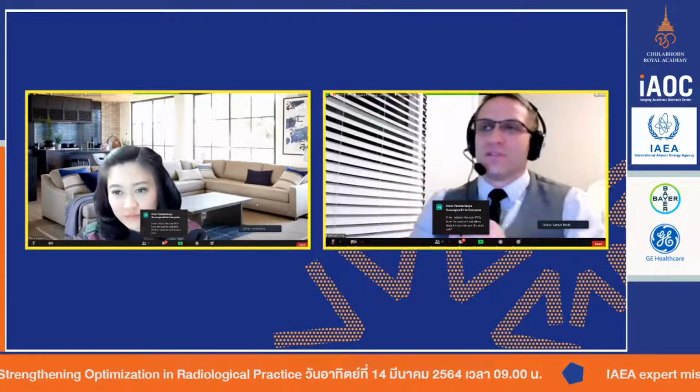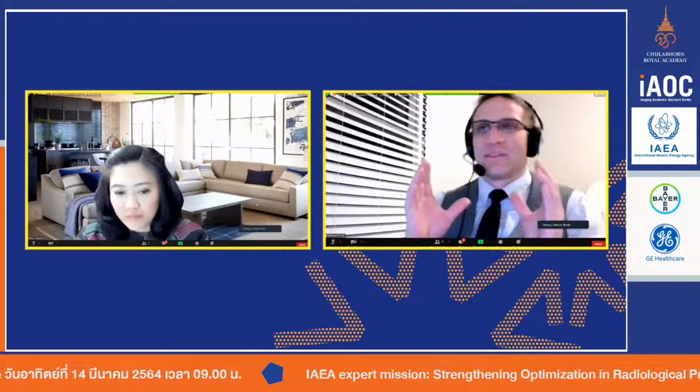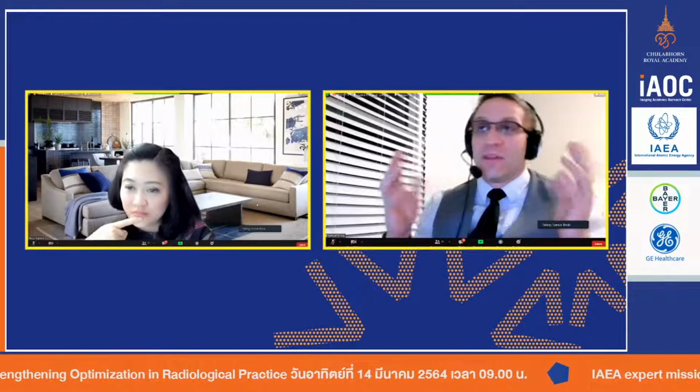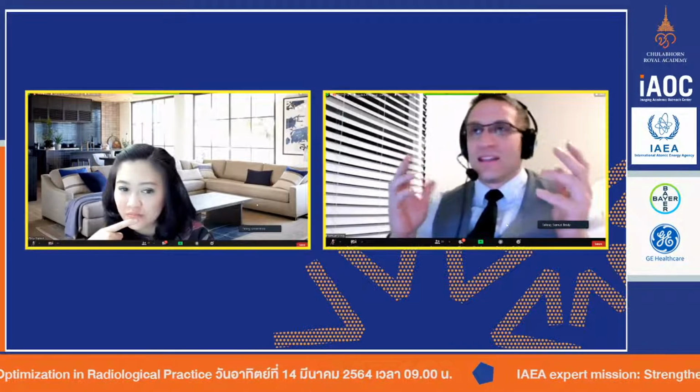For us in pediatrics, and I know you look at pediatric images all the time too, Tanya, the name of the game is we want to go as fast as we can because kids don't always cooperate. And some adults don't either, let's be honest. Some get claustrophobic and don't like having their heads inside the CT scanner, or they get older and can't hold still.